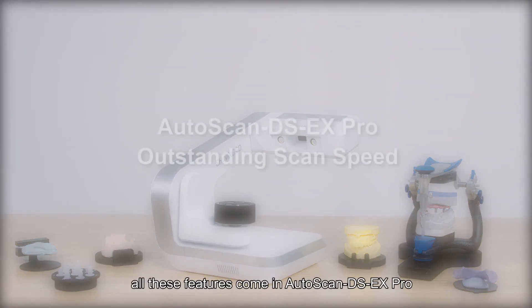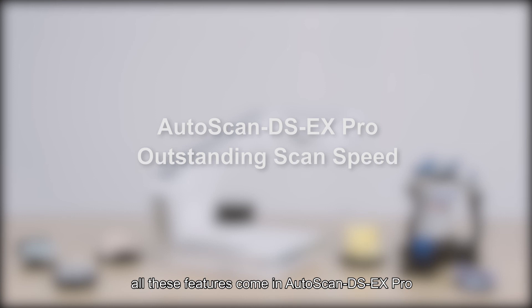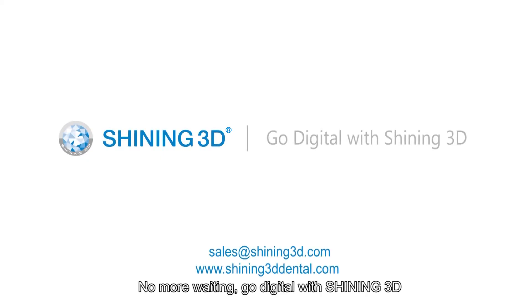All these features come in Autoscan DS-EX Pro with outstanding scan speed. No more waiting — go digital with Shining 3D.